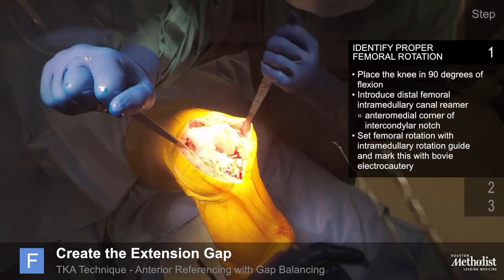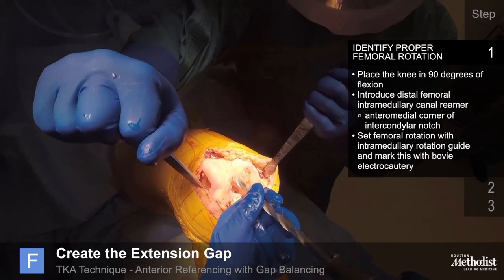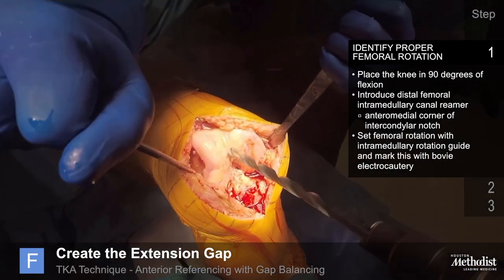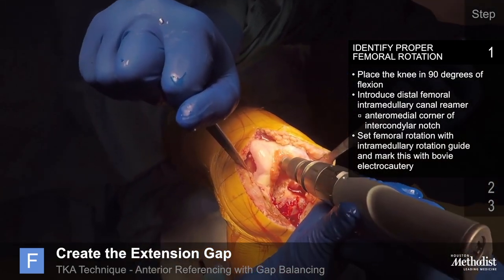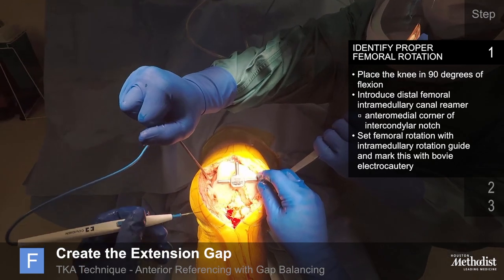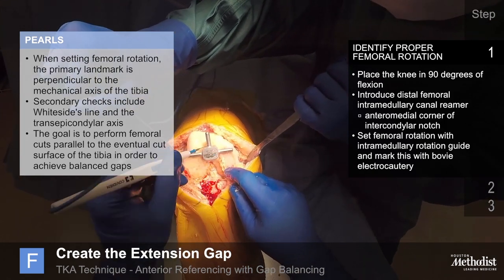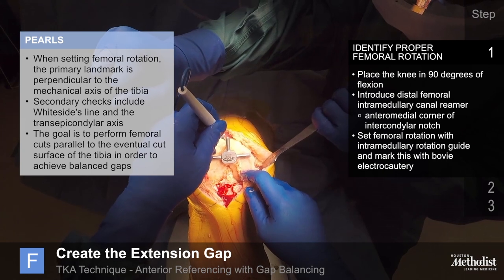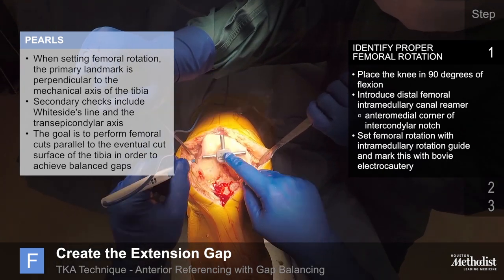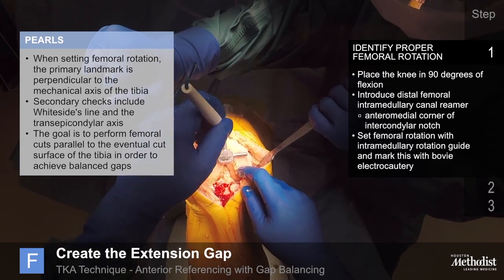There are three steps I pay particular attention to during total knee arthroplasty: femoral rotation, balancing the flexion and extension gaps, and tibial rotation. Place the knee in 90 degrees of flexion and introduce the distal femoral intramedullary canal reamer, best placed in the anteromedial corner of the intercondylar notch in line with the trochlear groove. Set the femoral rotation with the intramedullary rotation guide and mark this with bovie electrocautery. The primary landmark for femoral rotation is perpendicular to the mechanical axis of the tibia; secondary checks include the Whiteside's line and the trans-epicondylar axis. The goal is to perform femoral cuts parallel to the eventual cut surface of the tibia to achieve balanced gaps.